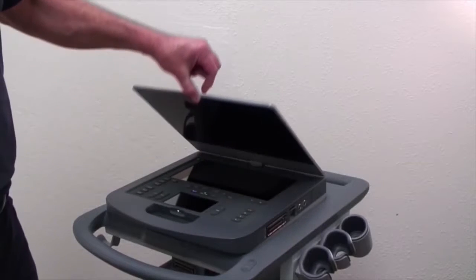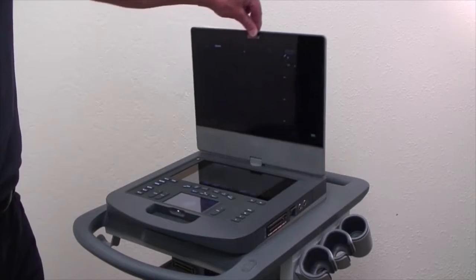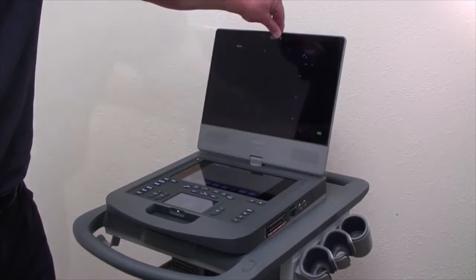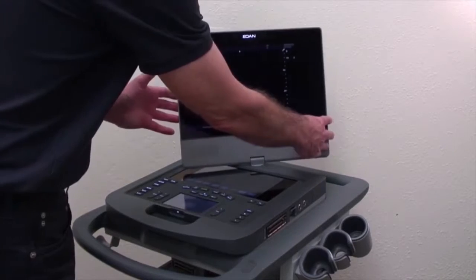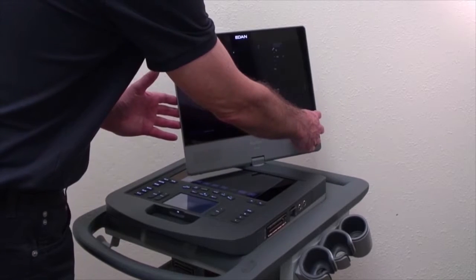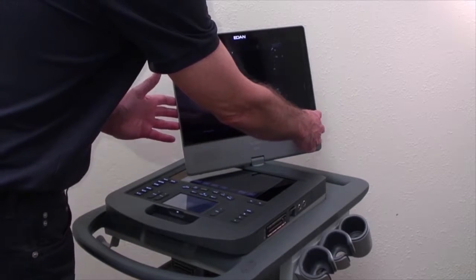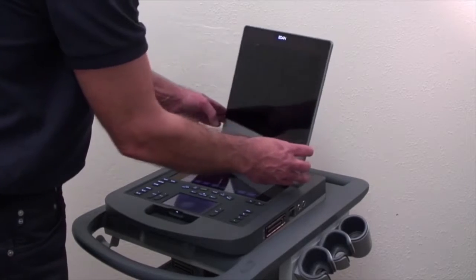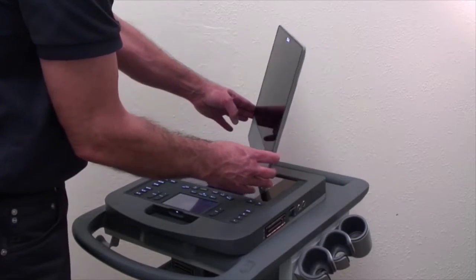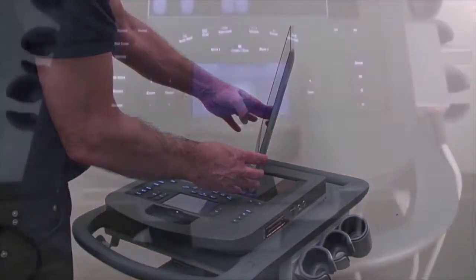The 15-inch high-definition monitor pivots and angles for maximum user comfort and clear screen visualization during procedures.